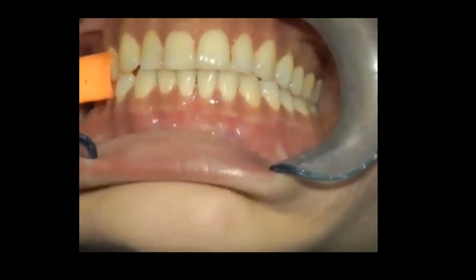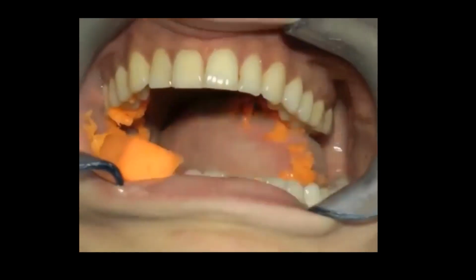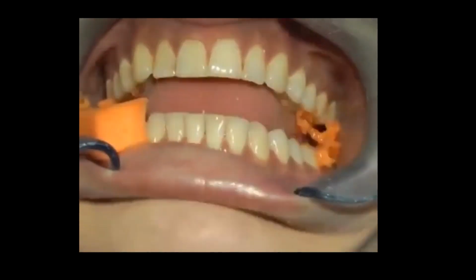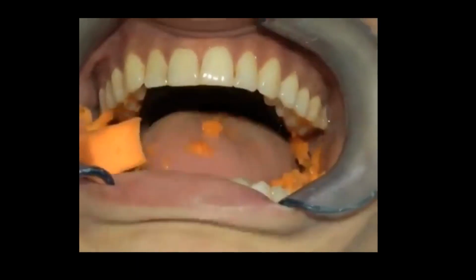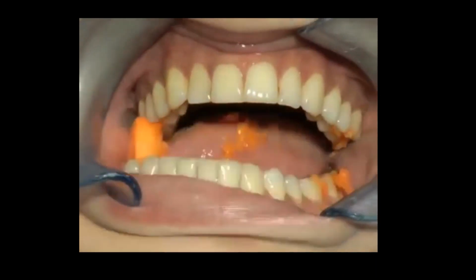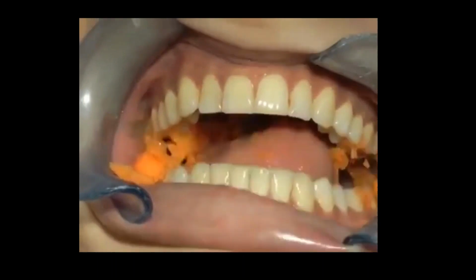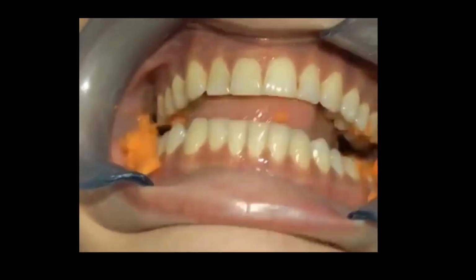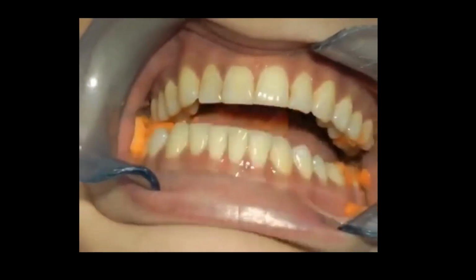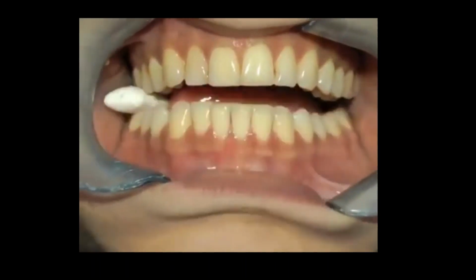So now everything's lined up to work. So you don't hit the guiding planes, everything slides in, you have a little bit of that helicopter pad to land in. But when you see them eating, are they eating straight up and down? You see that chew cycle straight up and down? No, it's not. It's on a cycle. Look at it. It's a teardrop. And look, there's quite an angulation to this. What are the back teeth doing? The back teeth are mincing. So they're mincing the food.